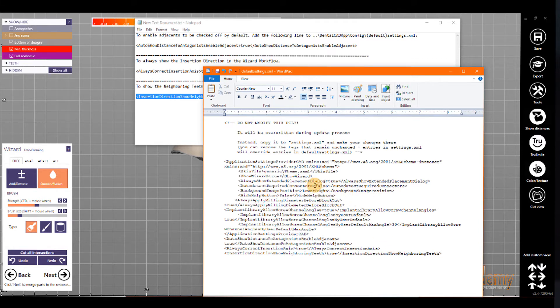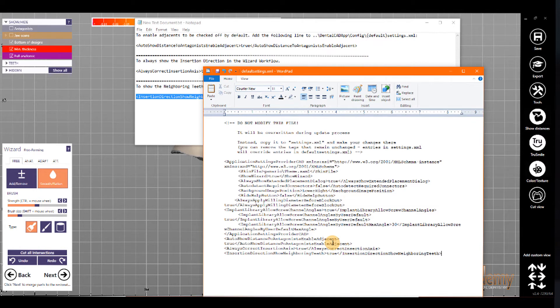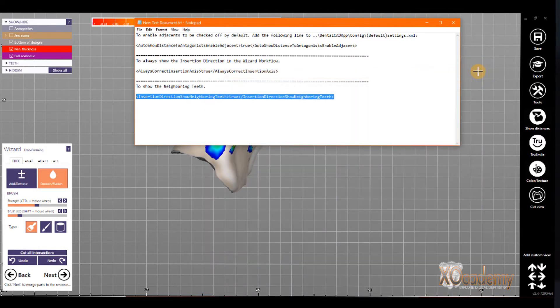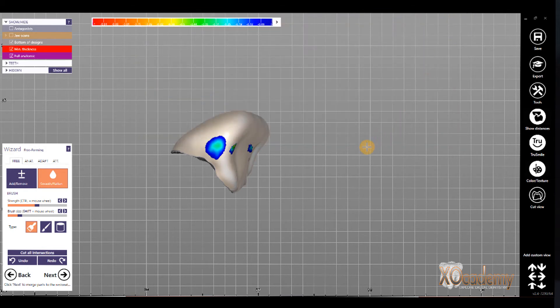You always want to make a backup of the XML file that you're editing just in case. Exocad doesn't just say, oh, there's an error here, and it doesn't process the error. It'll just crash. It just won't work. So, always make a backup before you make these changes.